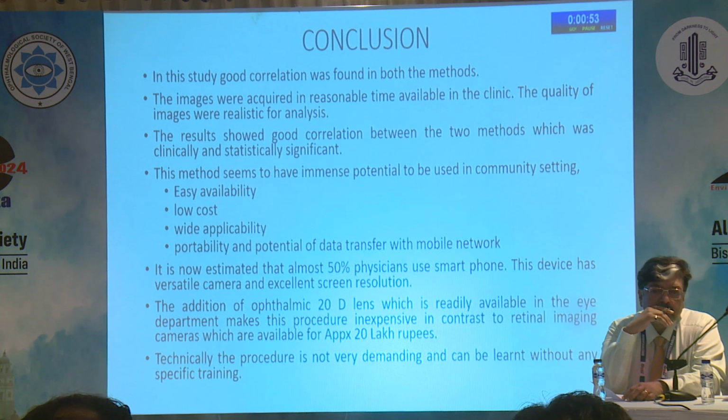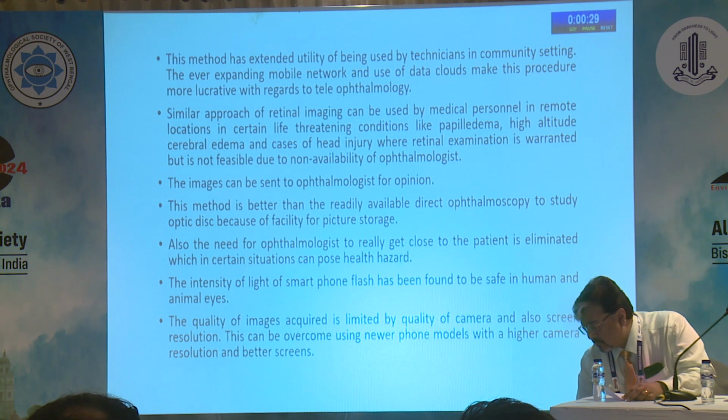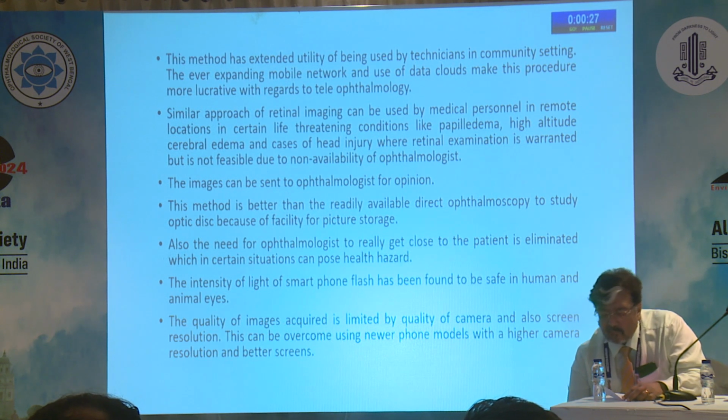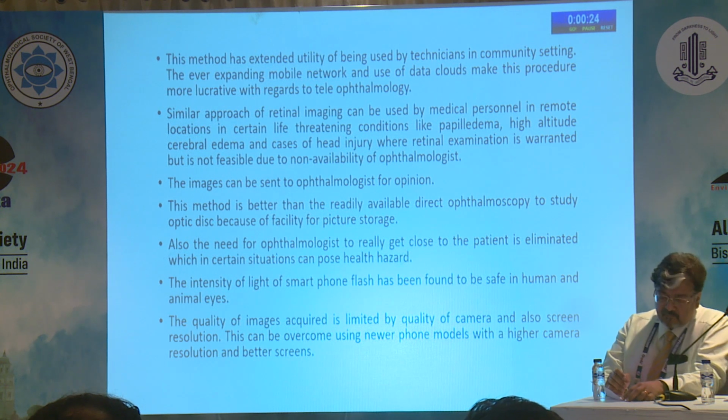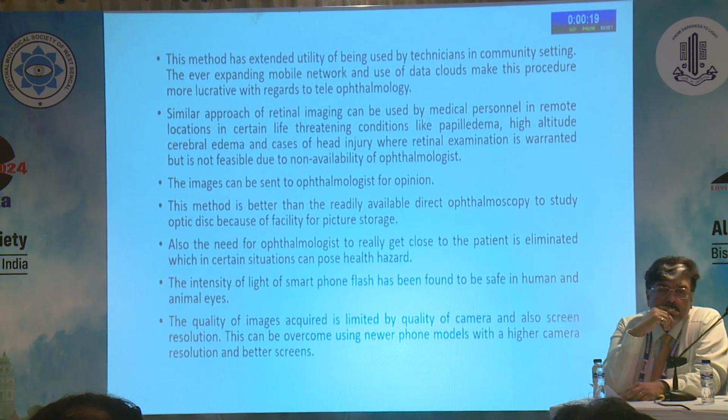It is now estimated that almost 50% of physicians use smartphones. This device has a versatile camera and excellent screen resolution. This method has extended utility of being used by technicians in community settings. The ever expanding mobile network and use of data clouds make this procedure more lucrative with regard to teleophthalmology. A similar approach of retinal imaging can be used by medical personnel in remote locations in certain life-threatening conditions like papilledema or high-altitude cerebral edema. The images can also be sent to ophthalmologists for opinion.